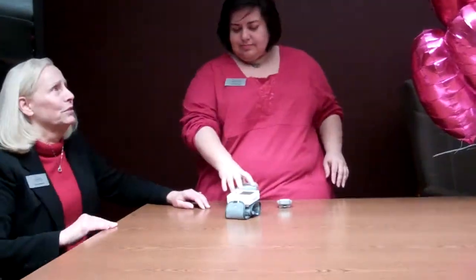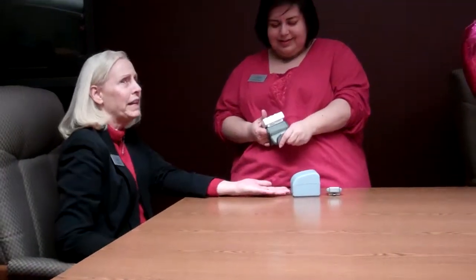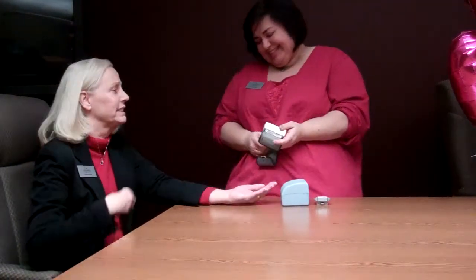Today your instructors are Laura Lindsey, Independent Living Skills Coordinator, and myself Linda Scribner, Senior Blind Services Coordinator. We're going to show you a talking blood pressure cuff and Laura is going to put it on me, which I could normally do myself, but I'm supposed to be quiet and at rest.